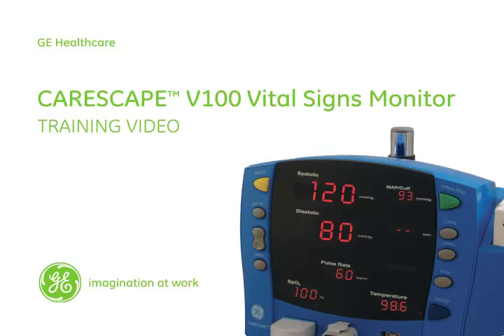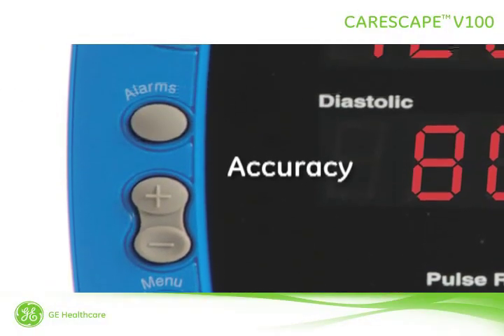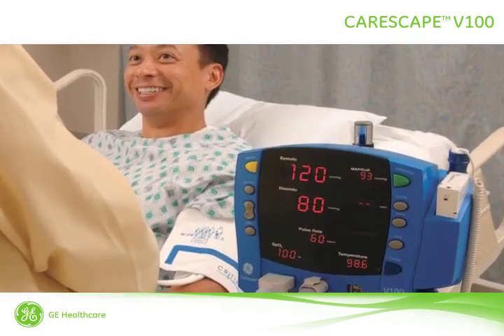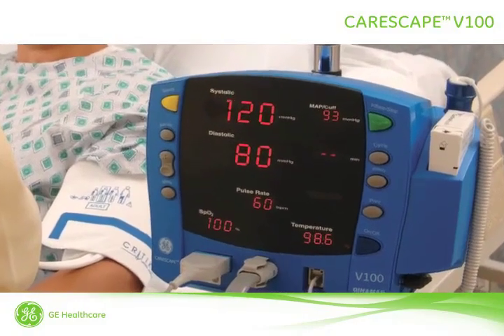GE Healthcare welcomes you to the Carescape V100 Vital Signs Monitor training video. With speed, accuracy, and connectivity, the Carescape V100 Monitor helps you manage clinical information logistics by collecting the right information at the point of care and presenting it wherever it's needed. This video is an overview of the monitor's operation and capabilities.